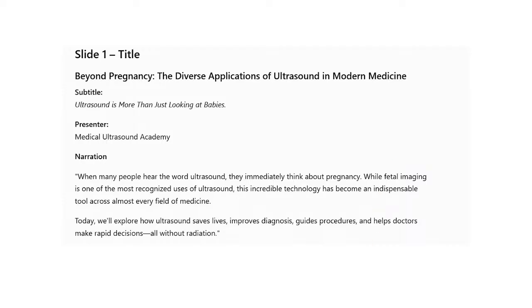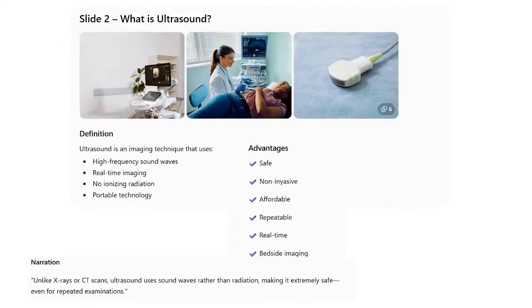When many people hear the word ultrasound, they immediately think about pregnancy. While fetal imaging is one of the most recognized uses of ultrasound, this incredible technology has become an indispensable tool across almost every field of medicine. So today, we will explore how ultrasound saves lives, improves diagnosis, guides procedures, and helps doctors make rapid decisions, all without radiation. So, what is ultrasound?